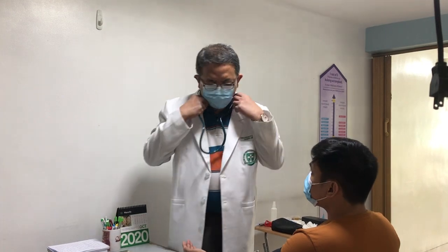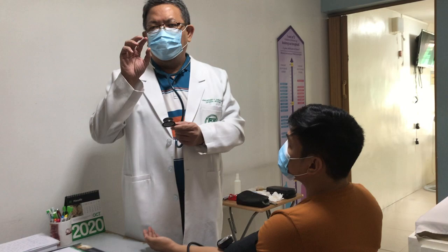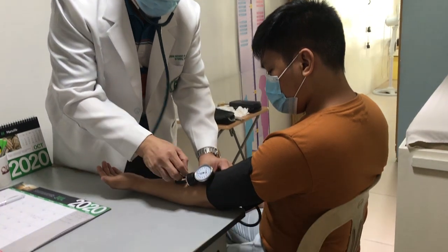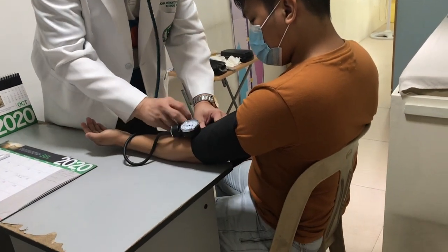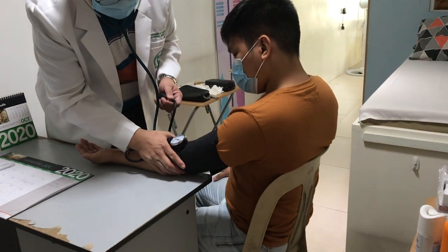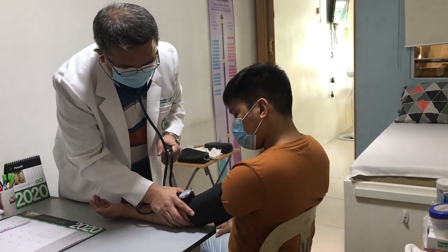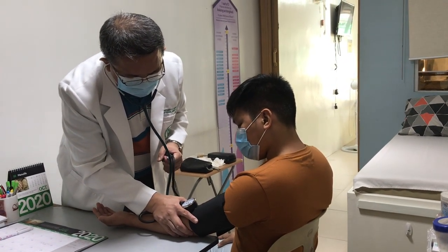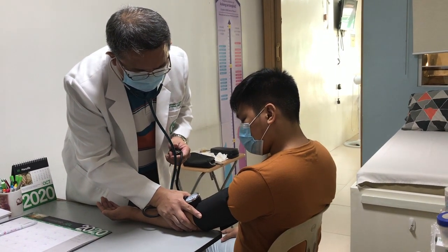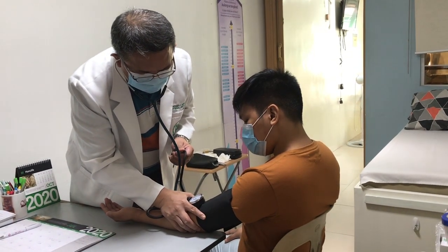Let's demo it now. We put the bell on top of the brachial artery, then inflate, and then deflate.